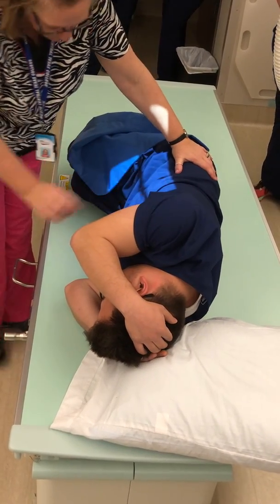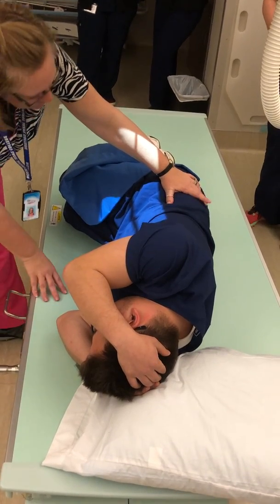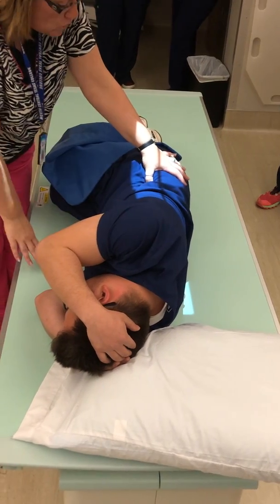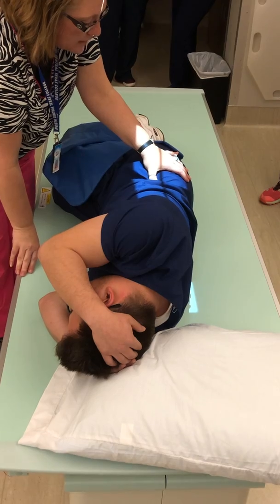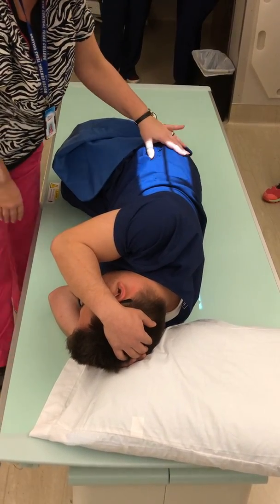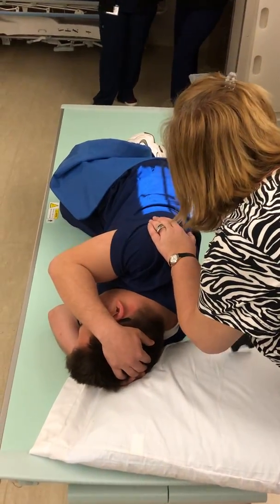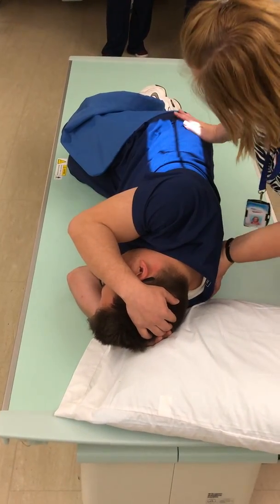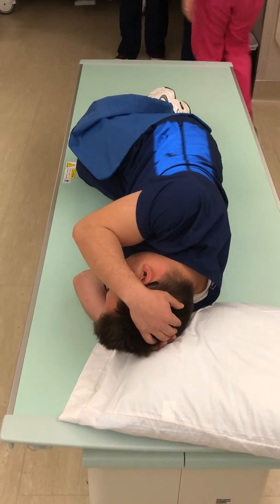All right, we want to be in the mid-coronal plane with a new IR, at the level of the crest for the lumbosacral, or 1.5 inches above if it's going to be just lumbar. Okay, I'm going to make sure that he's truly up and down. And again, I'm going to bring your shoulders back just a hair so that we're truly in alignment. Let me get back here.